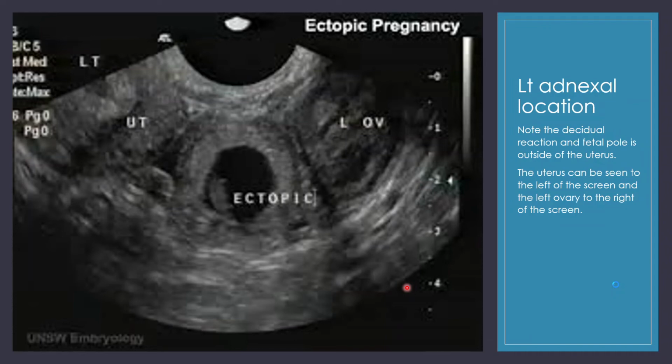So, I know that kind of worries you and you're like, oh no, what if I miss something? Remember, we are not diagnostic, okay? We are there just to show the heartbeat, the baby, show the mother what's there. But if we see the pregnancy outside of the uterus, we go into the mode of taking care of what we need to do as far as that protocol goes.